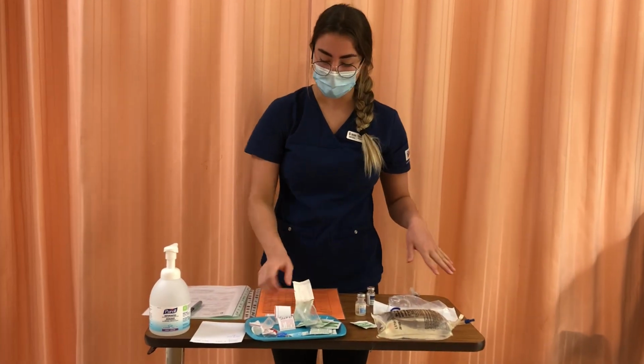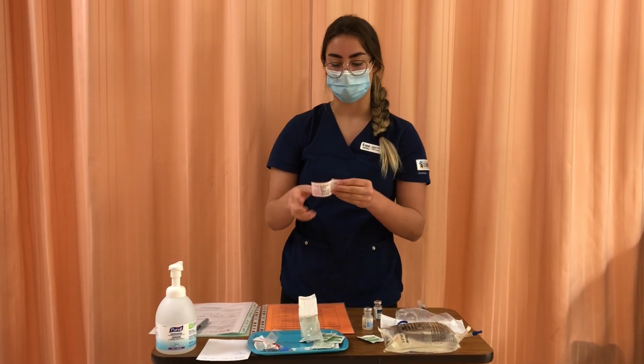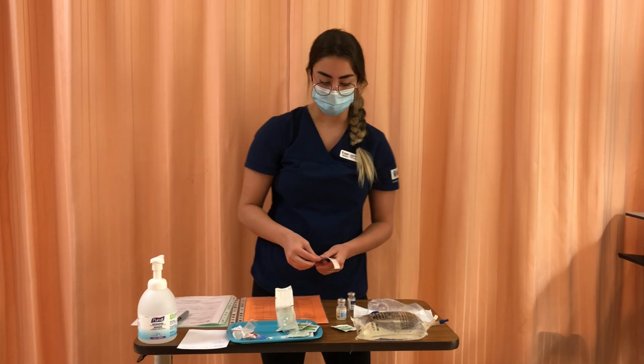Okay, so once I've done that, I can write my med label. I've written all the information on here. So I can attach it to my syringe, and then I'm ready to do my second check.